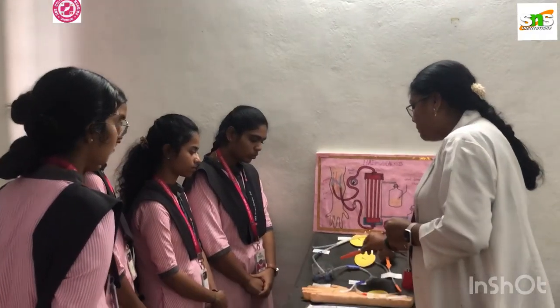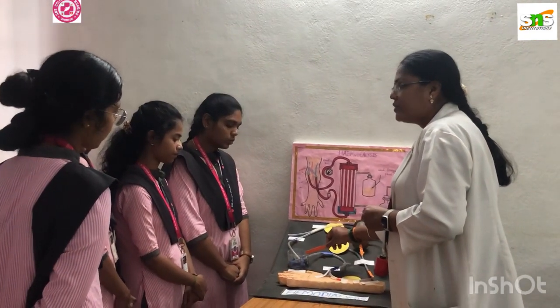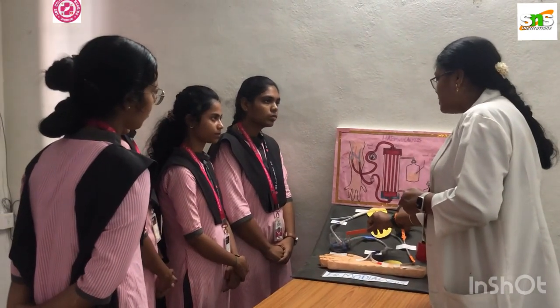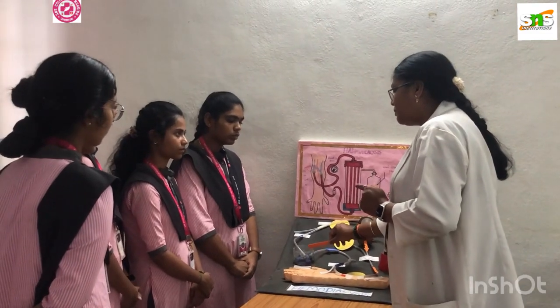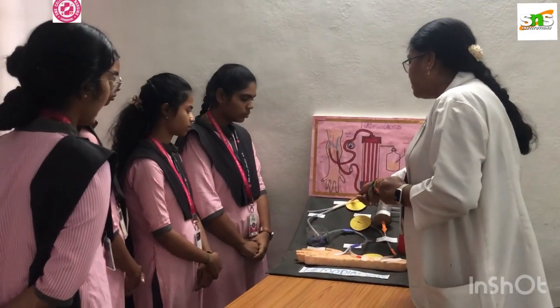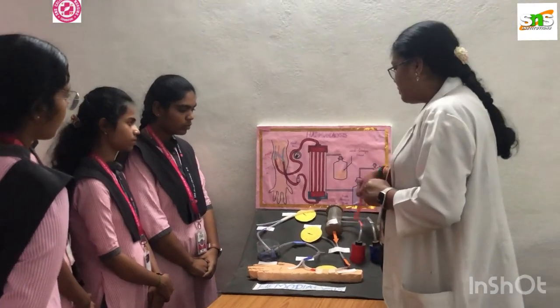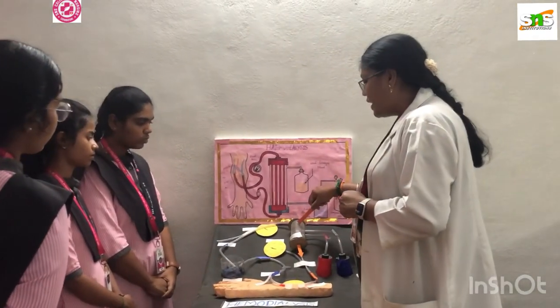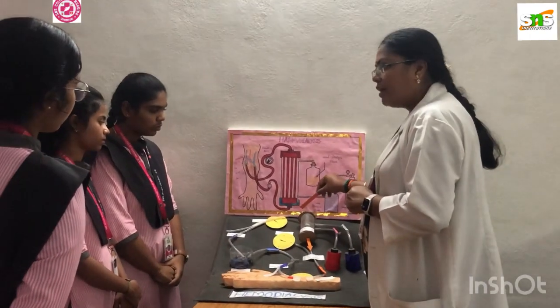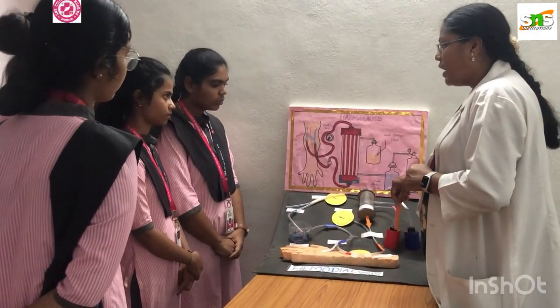The blood is taken up and pumped into the blood pump, where the pressure will be increased. You know the arteries have more pressure, yes or no? The cardiac blood pressure is directly reflected in the artery, so the blood flow and pressure will be more. It enters the blood pump, then is taken out to the filter. This is the dialyzer, or the filter, where things will be filtered. The fluid is pumped into the dialyzer filter, and the air trap collects any air inside the arterial blood in the air filters.